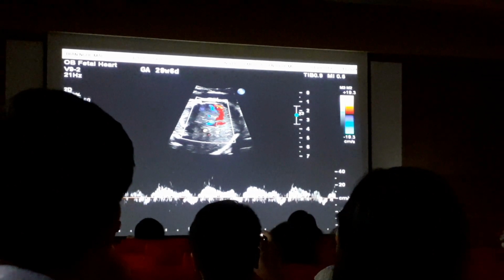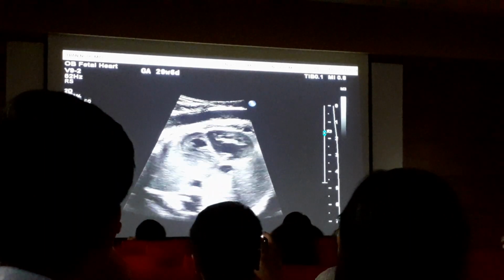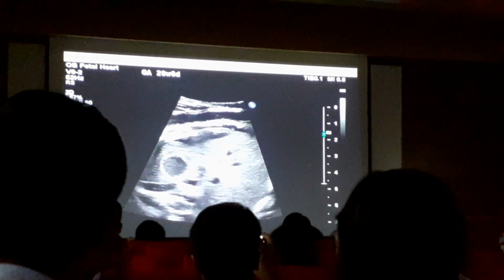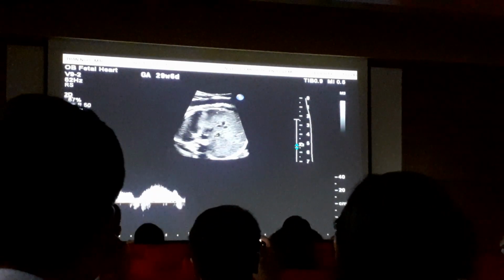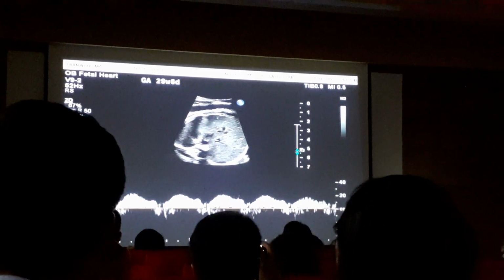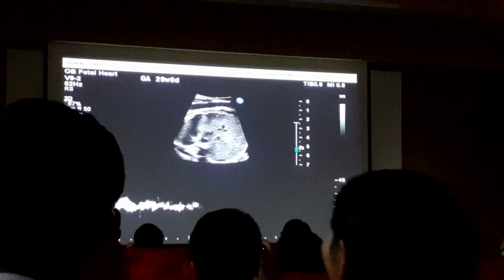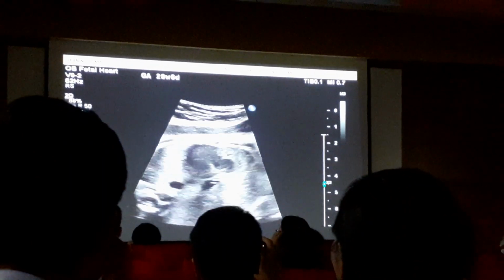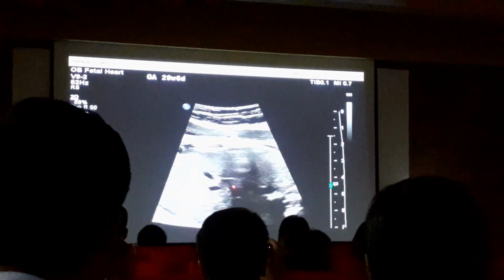Also normal. Pattern recognition. And inferior vena cava, we can also sample. Also looks normal. Cái này là cái tĩnh mạch chủ dưới, chúng ta thấy cũng kiểu bình thường. Then we'll get to the heart and continue our investigation. Mình tiếp tục, mình tiến sâu vào tim, đường vào tim.